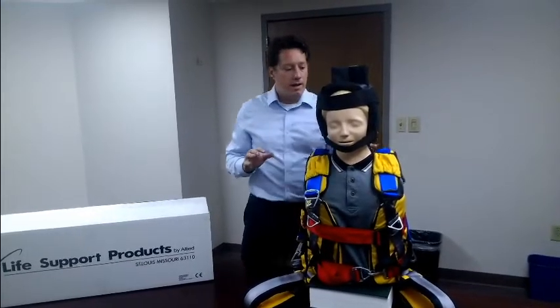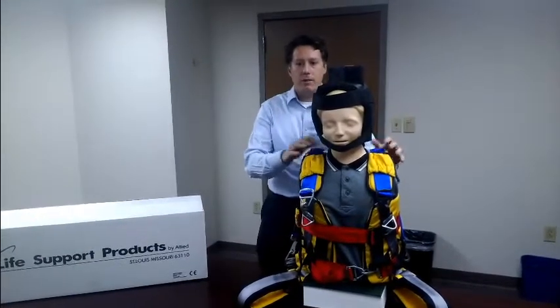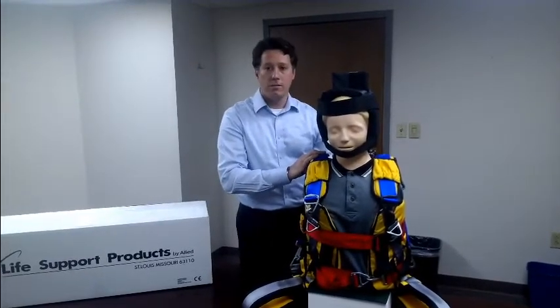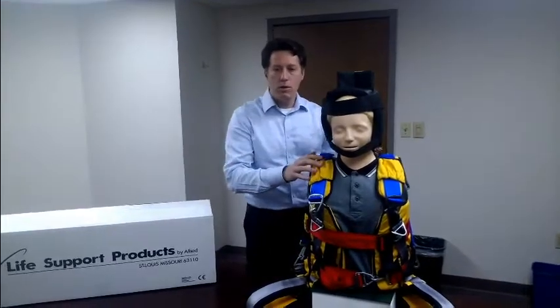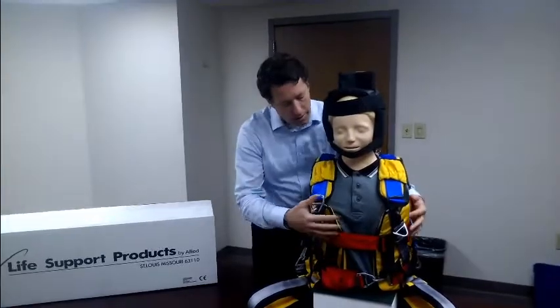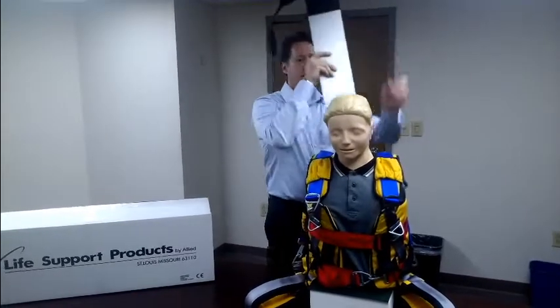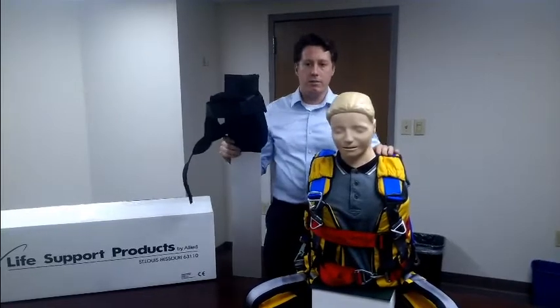What makes the LSP Halfback unique is that it combines the capabilities of a full body harness with the ability to immobilize the patient if spinal trauma is suspected. The device consists of two main parts: the first is the full body harness, and the second is a removable backstay. The two-piece design has some distinct benefits.